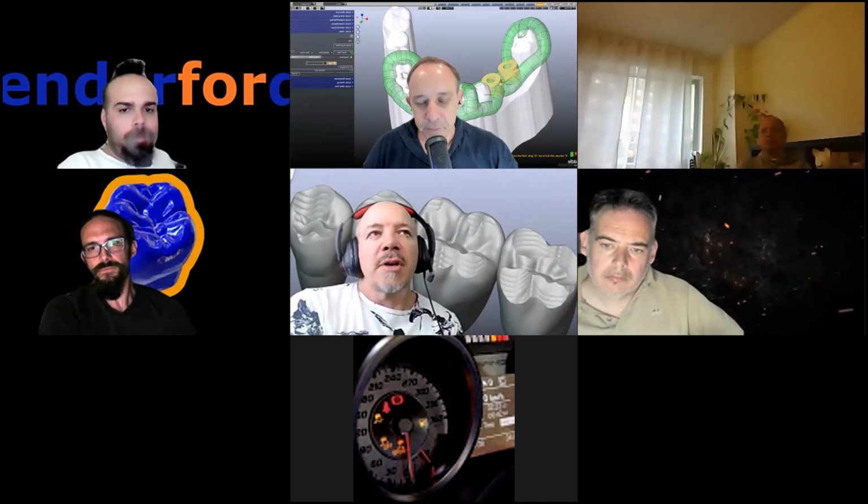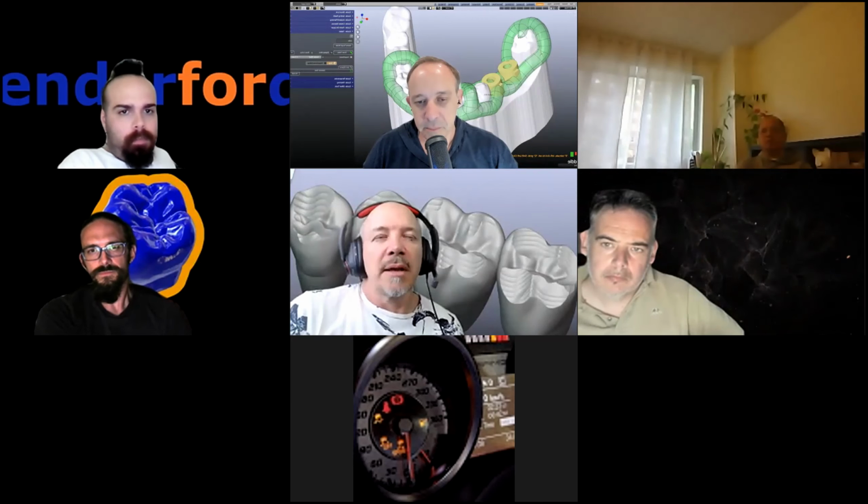So Michael, you're still going to do the single crown using the articulator module, weren't you? Yes, I'm going to do that. That's a good inclusion to stage one. I'm going to do that because the articulator is very important, so that we can get all the excursive movements and all of that stuff. Okay, excellent. Are there any questions still? Do you need more learning files or more scan models or anything like that? I need the learning files for the workshop module.